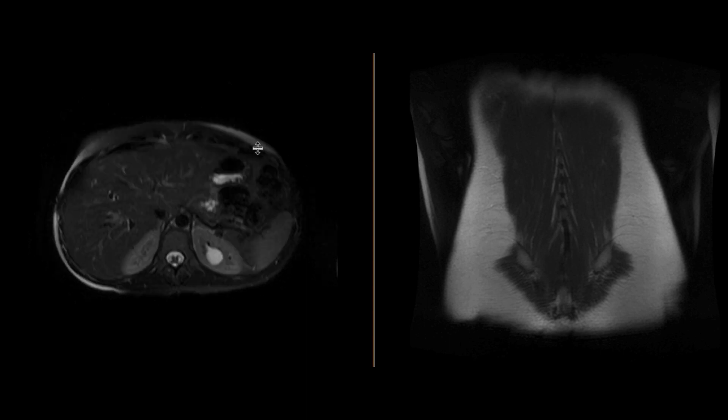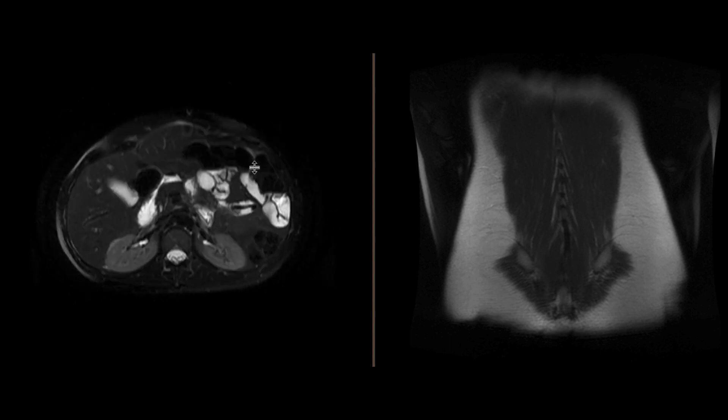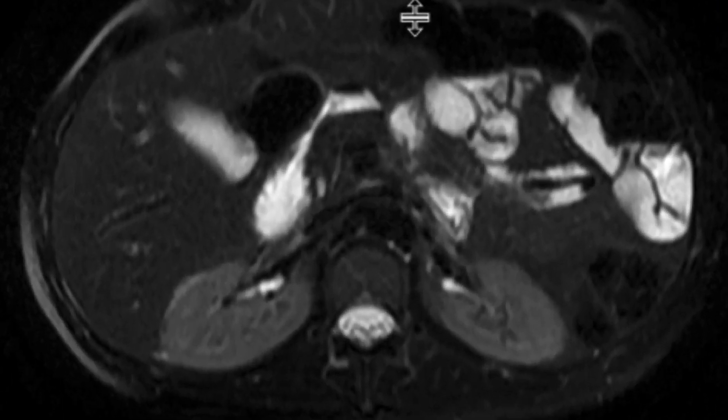We perform these MRIs without intravenous contrast. We have multiple sequences, and these two sequences are the ones I want to focus on.